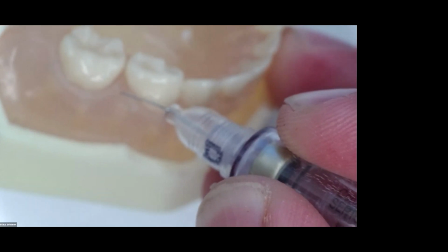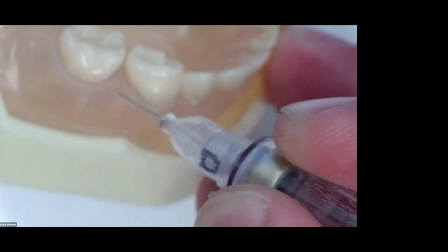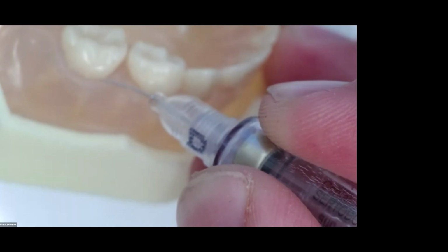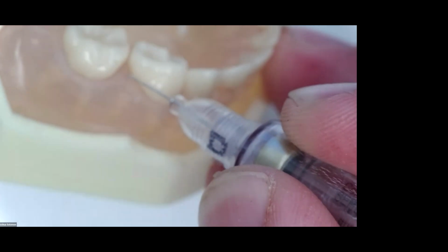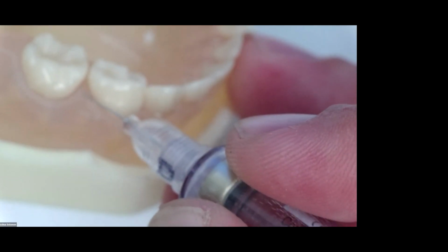And again, all of us get heavy-handed. If you start here and you start injection, it's easier to drift forward, and the tip of that needle can get too close to the PDL of, in this case, the E. So I'm going to start about 2 millimeters away from mid-papilla. I'm at about 15 degrees. And I'm going to enter for my first stage.